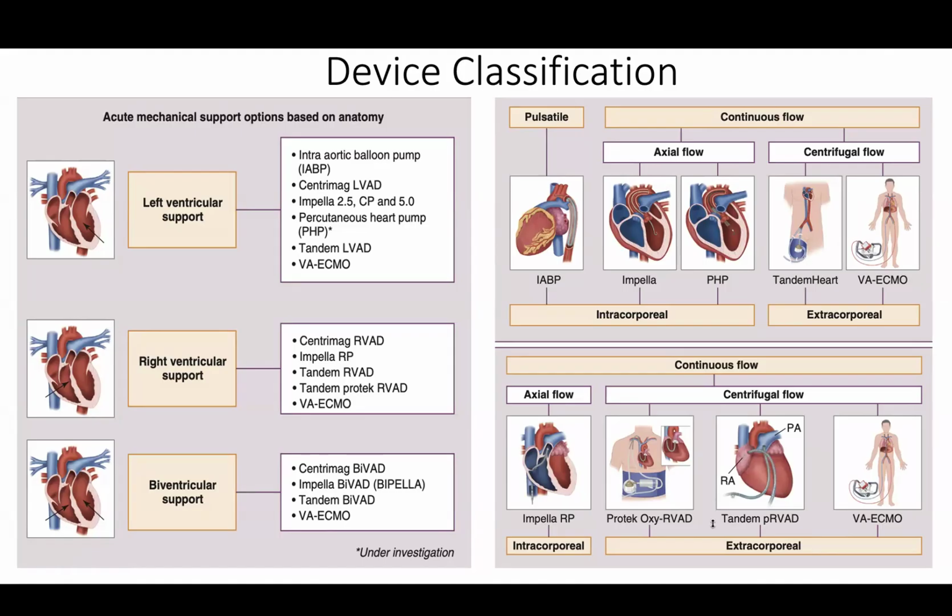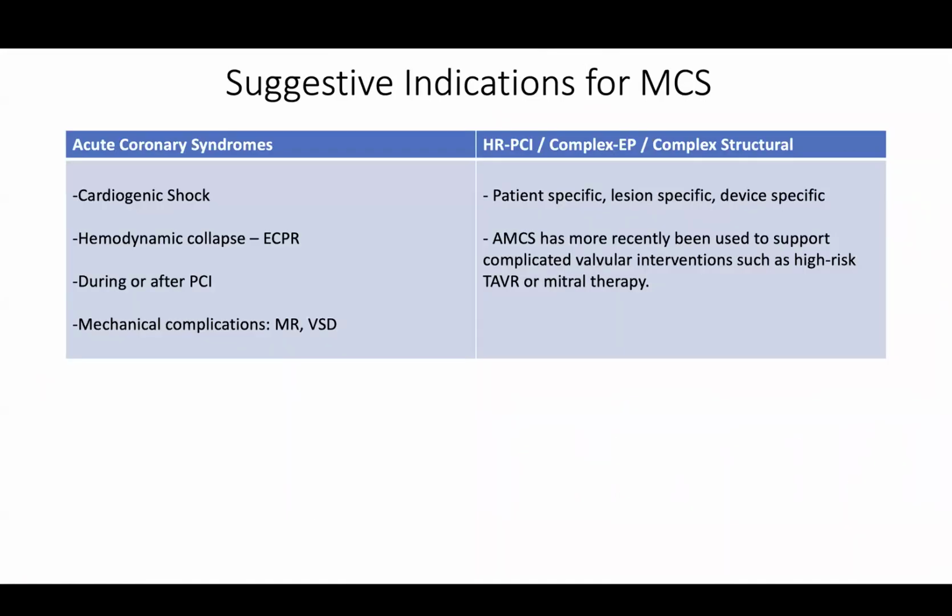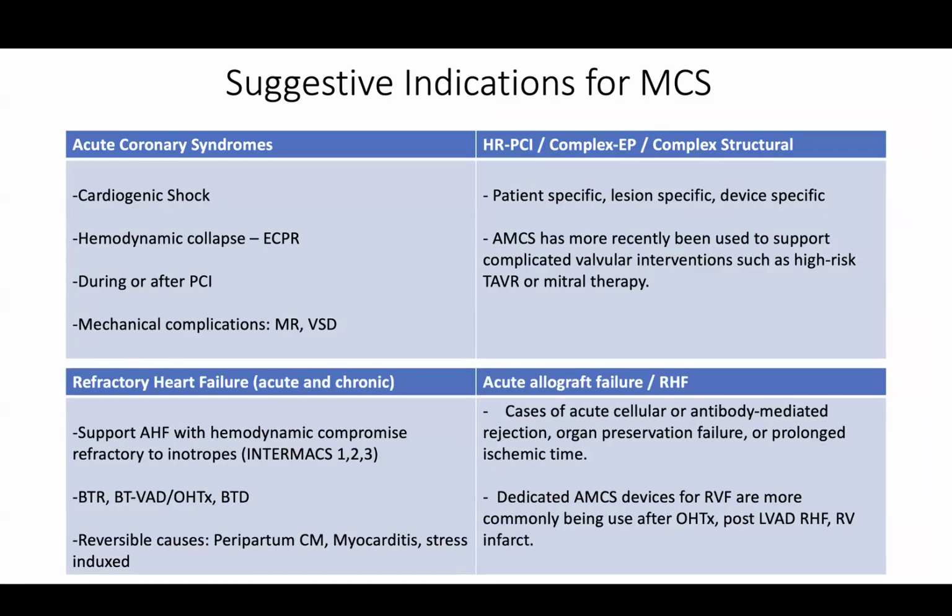And then, oh, I lost my slides here. Are they inside the body or outside the body? So this is just to classify them based on anatomic support or how they work. Here are probably some of your board questions. So the indications for MCS and more importantly, the contraindications. I don't think I need to go over this.